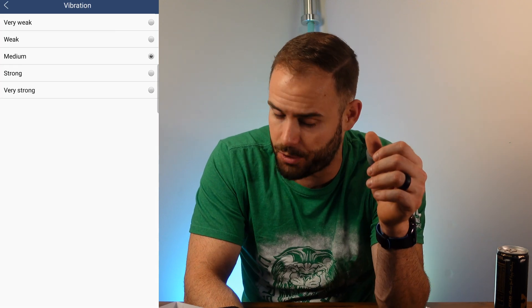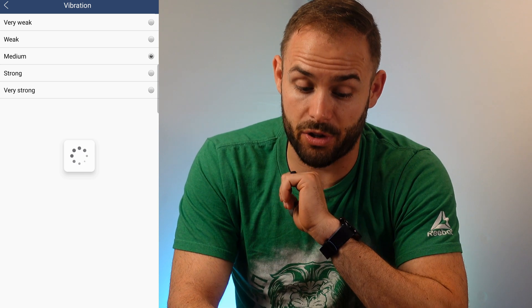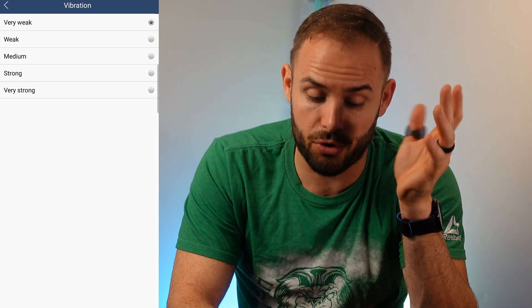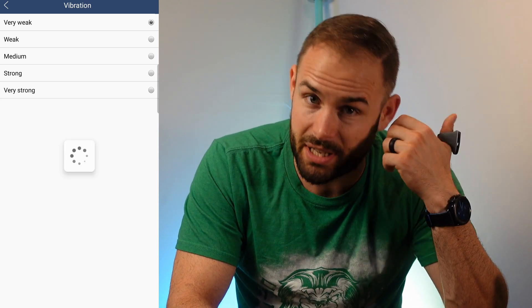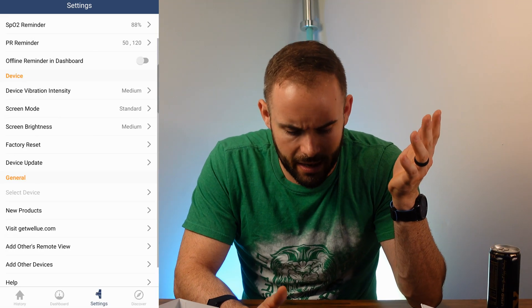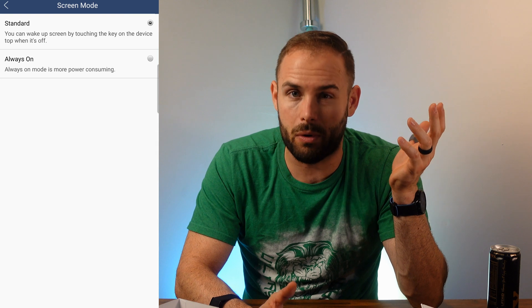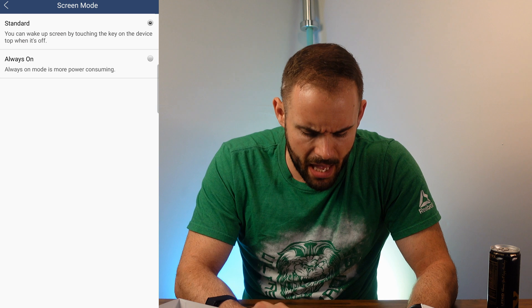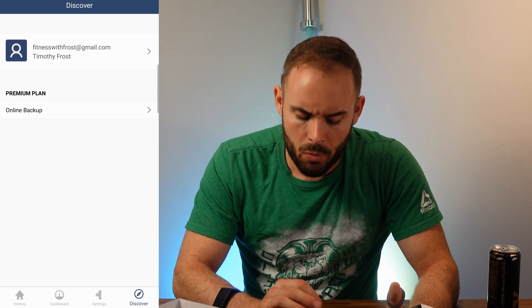I chose medium vibration intensity — strong is pretty strong, and weak is really weak. It really depends on how hard you sleep and how urgently you need a notification. I liked medium; it wasn't too loud. You can also change your screen brightness, which affects battery life, and set a screen-always-on mode. You can also discover new products within the app.